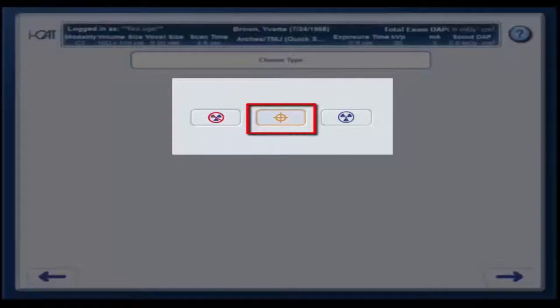You may also use a scout scan for a hand-wrist image to observe growth plates. The full scan is used for diagnostic purposes. This can be either a CBCT scan or a pan scan.